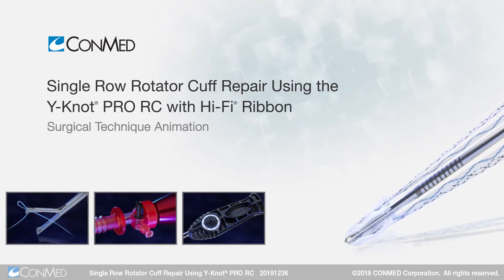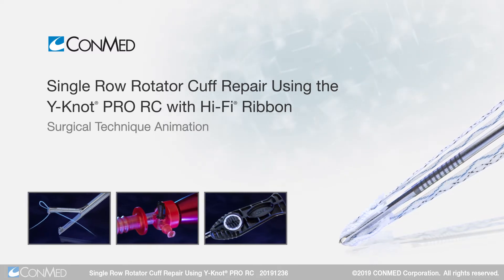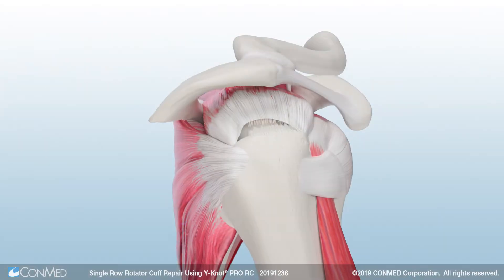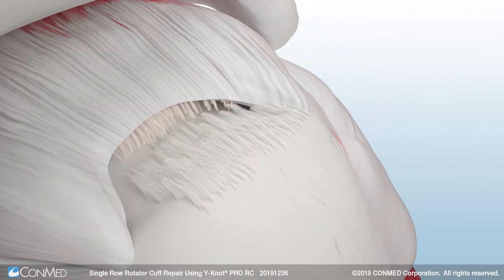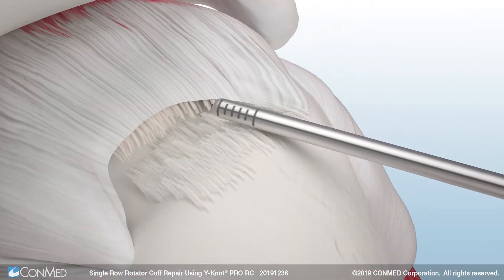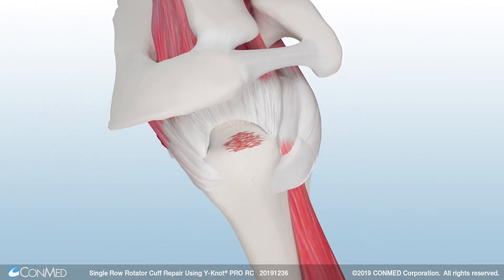This technique demonstrates an arthroscopic single row rotator cuff repair using ConMed's Y-Knot Pro RC with Hi-Fi ribbon. First, prepare the footprint in the subacromial space using ConMed's dual purpose shaver blade featuring exclusive stealth technology.